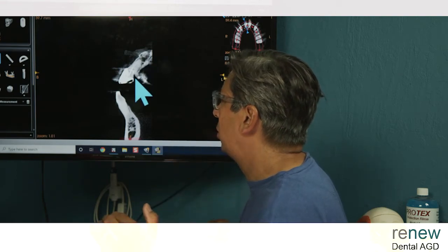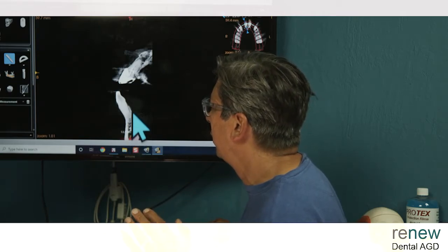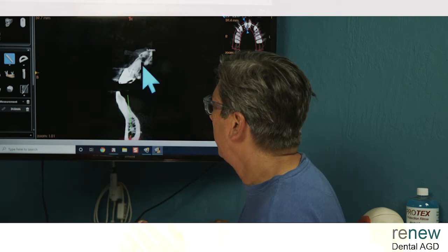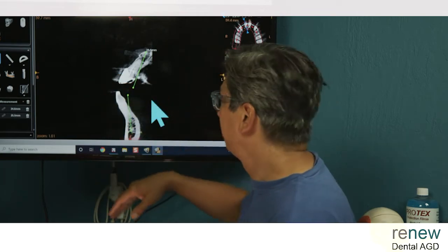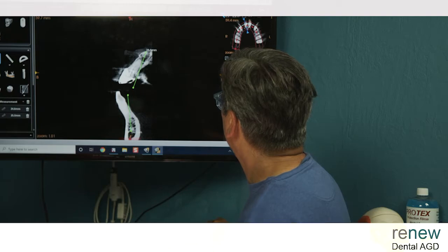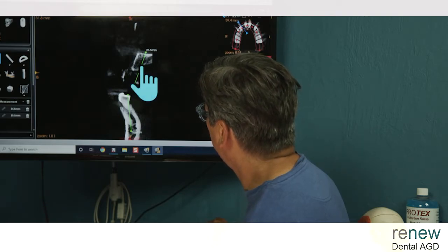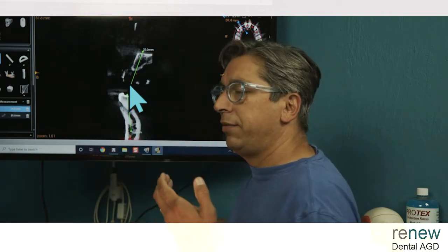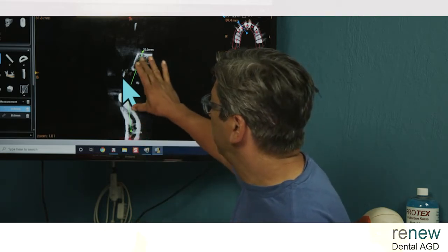Dentures in his future. The problem with him with the dentures is that if he keeps the lower teeth here, or even if he doesn't, his bony arch is going to be here. His bony arch is going to be here. And having this as the cantilever out in the front is very, very difficult, even if he has a hybrid or any of that stuff. And you can see here's his bony arch on number 7, and this is probably going to be it. So this would be better, but when you have to set the teeth, in this guy's case, try to get him some sort of balanced occlusion. Let's say he had a full upper and a full lower, and this is how the bone ended up.